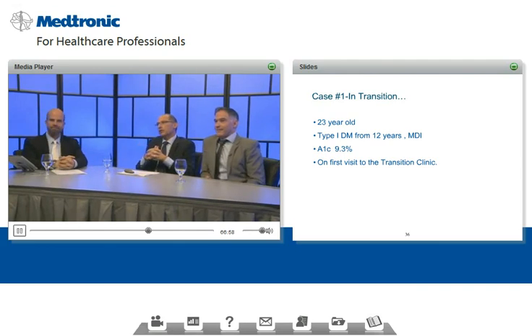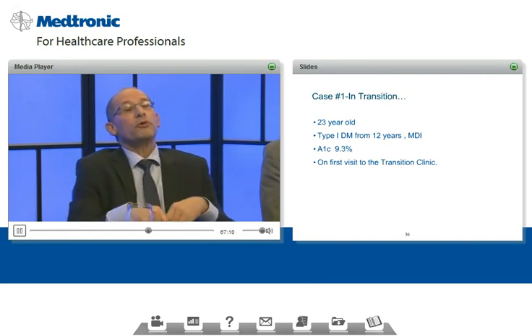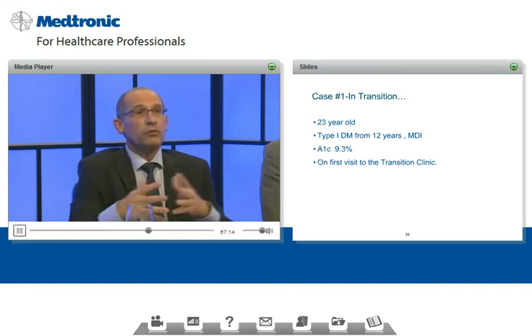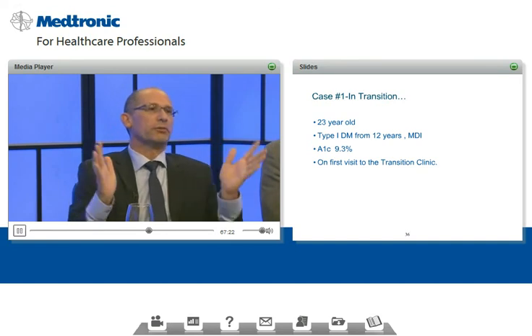And in this case, we're going to present two cases, real true cases. And during the presentation, we'll do a small pause, and we'll ask the participants to put in their inputs on what they would do according to their polling questions that we'll show you in a moment. So this will be an interactive part of this presentation. So let's look at case number one.